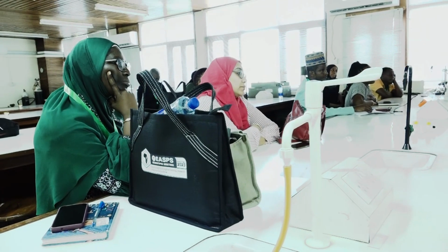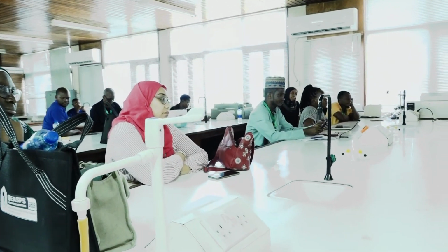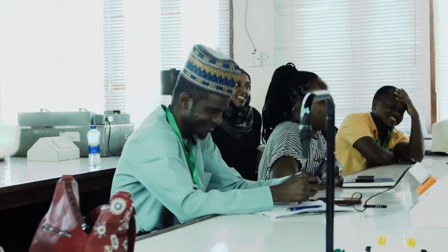And the other one that we use is a quite simple device called a finger pulse transducer. It basically measures tiny changes in pressure. So your blood pumping through your finger is detected by this device.